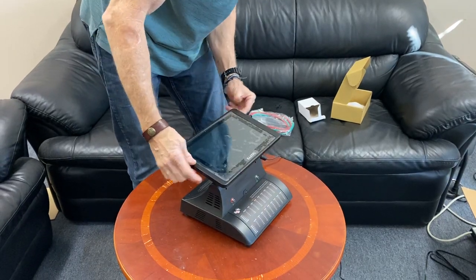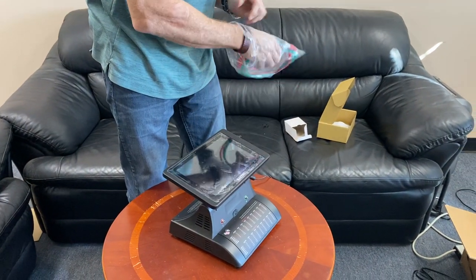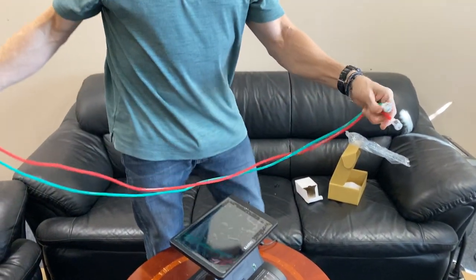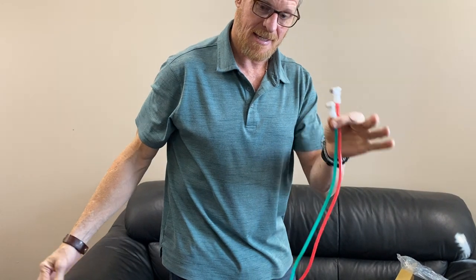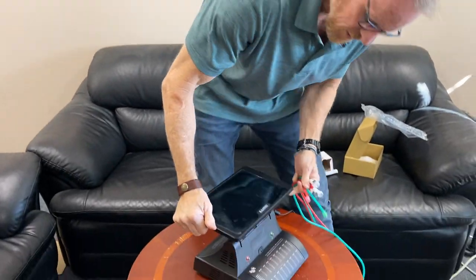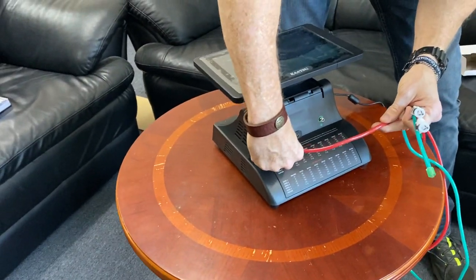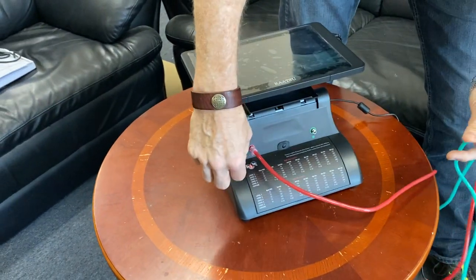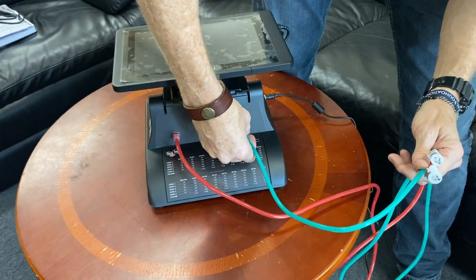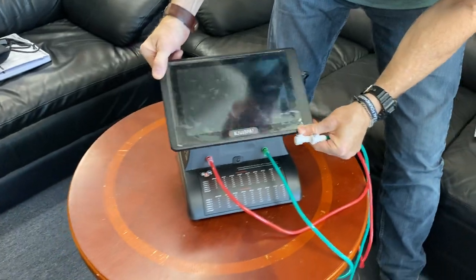Before we turn the device on, we want to hook up the air tubes. The air tubes have two sides — one connects to the air bands and the other connects to the Master 2.0. Take the red tube, connect it, and give it a clockwise twist — it only takes about a quarter turn. As soon as you feel it starting to get tight, that's plenty. Same with the green tube: quarter turn, gets tight, and now we're ready.